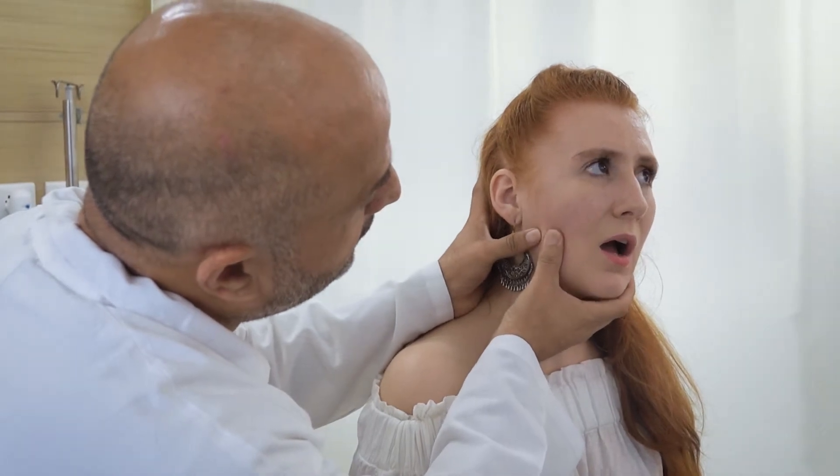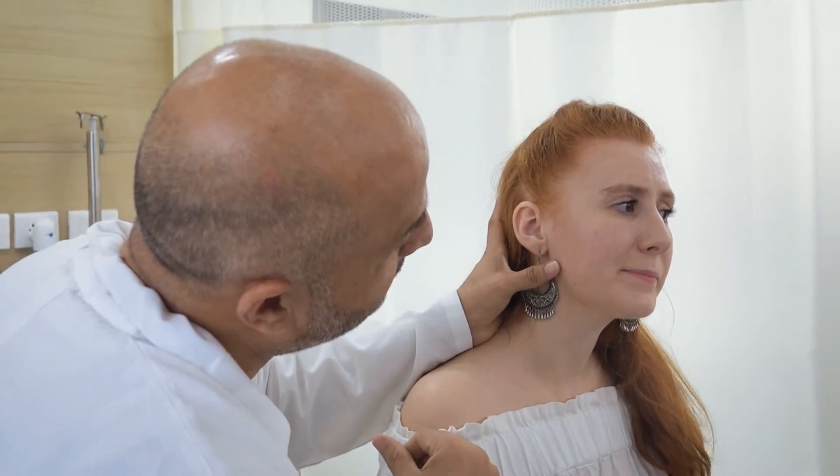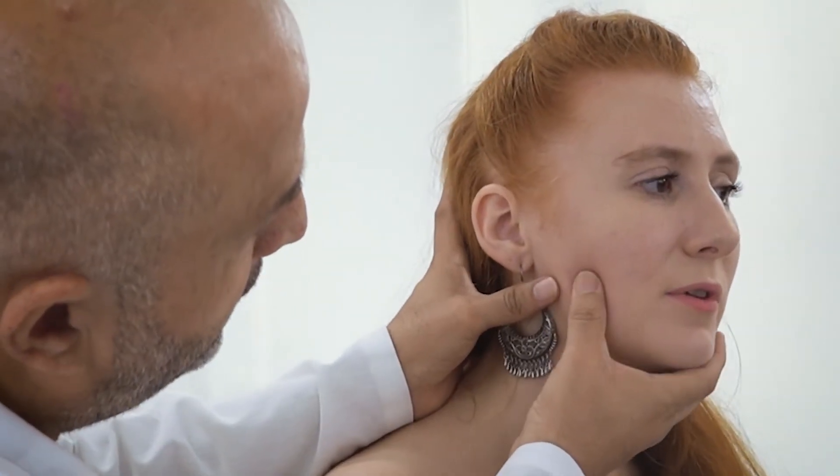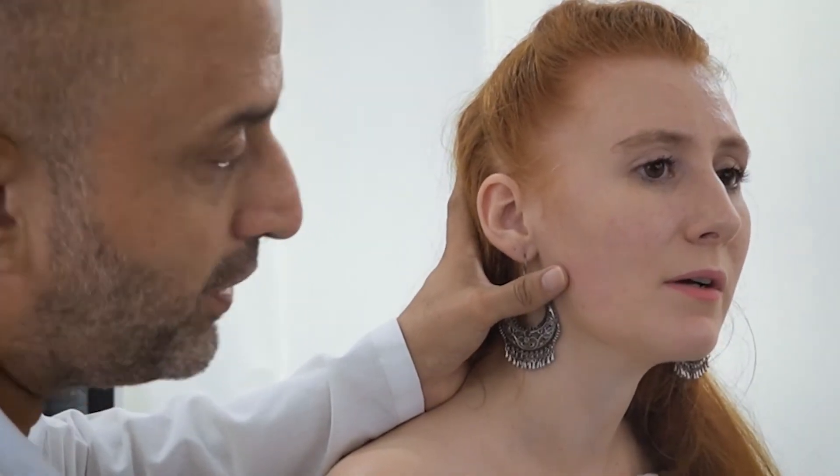Identify the tender points and concentrate the treatment with Cura Laser over this area for optimum results. The surface area of the jaw is very small, so use the small therapeutic head to cover the area in a single treatment session.